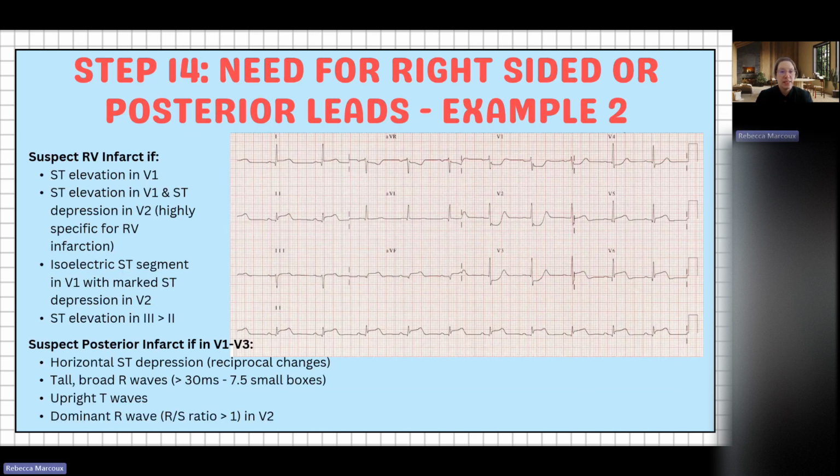Okay, this is the second ECG we're going to look at. If you have the little workbook that I sent out, this is number 2, example 2. I just want you to take a quick look at this ECG and tell me if you think there's a concern for right-sided or posterior leads.